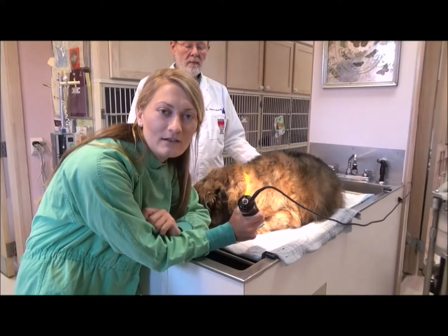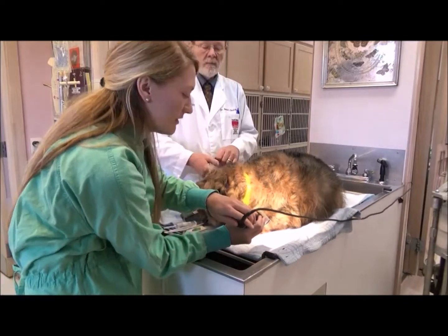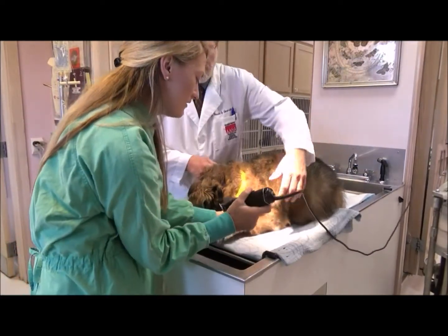I'm now going to begin to prep the leg to place a cephalic IV catheter. So I'm going to begin by clipping the hair on the leg.